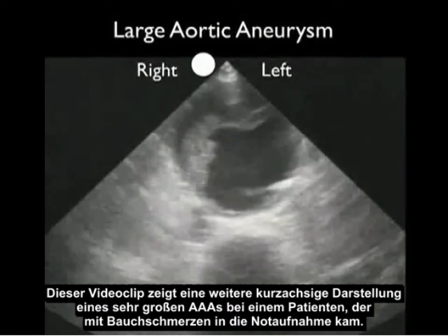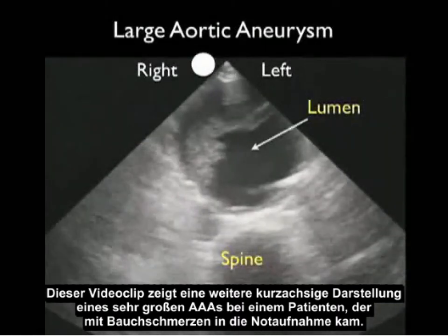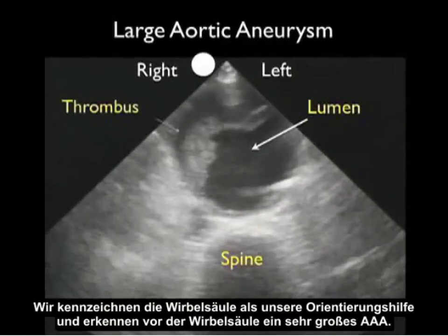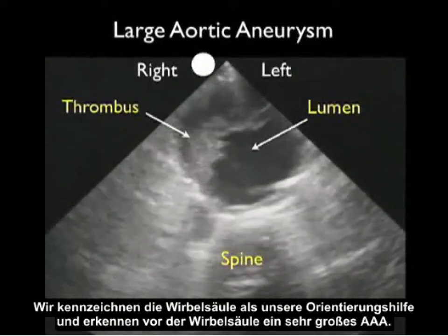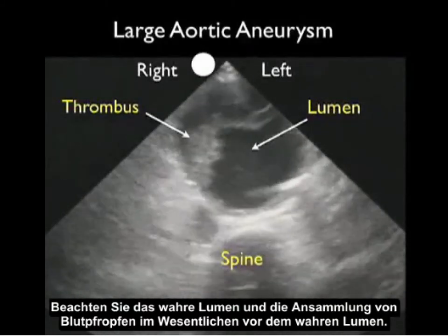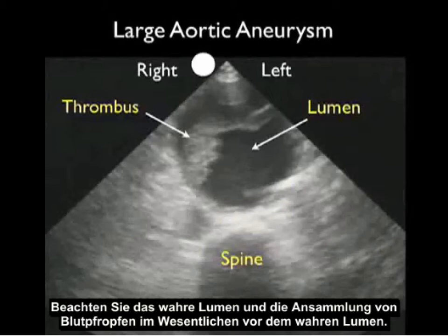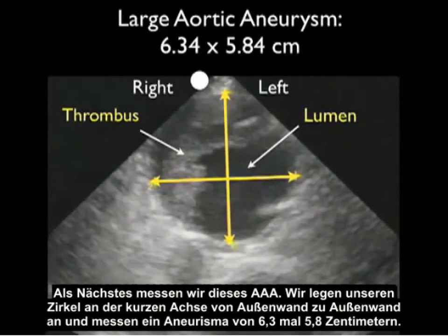This video clip is another short axis orientation of a very large AAA in a patient who presented to the ED with abdominal pain. We mark the spine as our landmark, and anterior to the spine we see a very large AAA. Notice the true lumen and the accumulation of thrombus seen substantially anterior to the true lumen. We've placed our calipers from outer wall to outer wall in a short axis configuration and come up with an aneurysm of 6.3 by 5.8 centimeters, again meeting the criteria of a very large AAA greater than 3 centimeters.